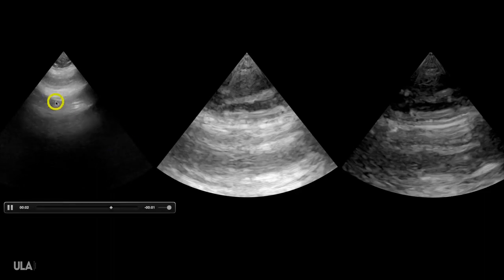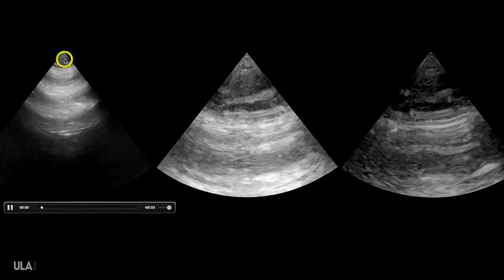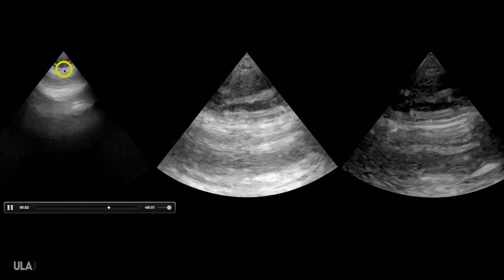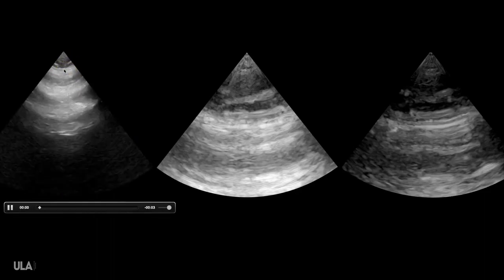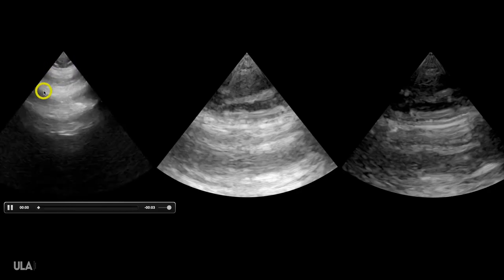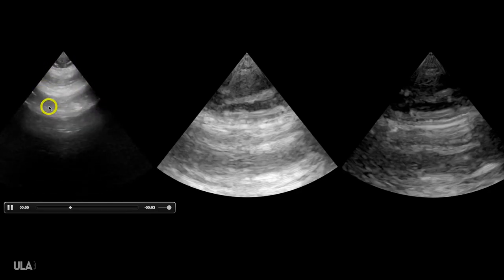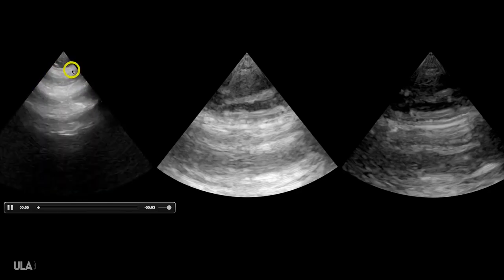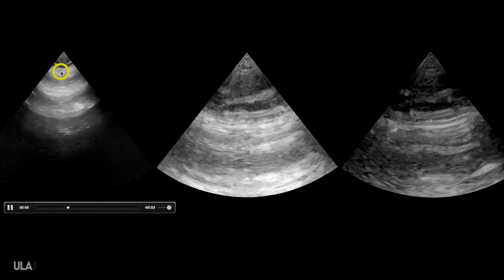So over here we have a phased array transducer. It's a little bit fuzzy because this is the lowest frequency transducer we have, but I can see some movement up here. This is an A-line, A-line, A-line. This is a pleural line and I can see movement there.